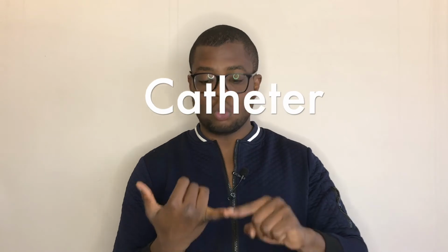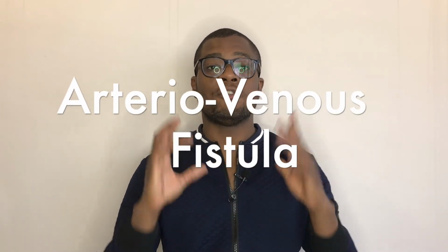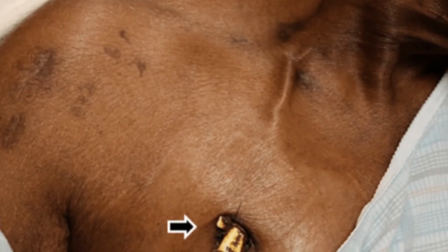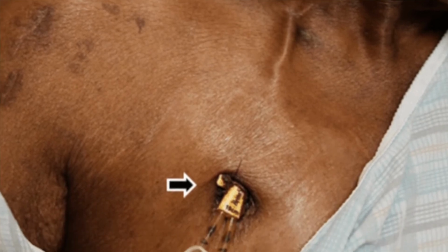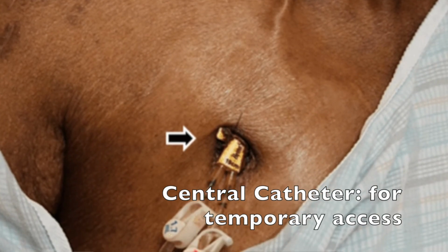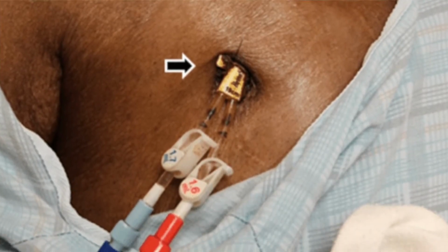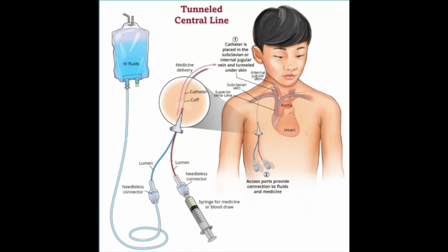There are 3 main accesses that you can use for dialysis, essentially because you need to remove blood from the body. It's either a catheter, an arteriovenous fistula, or an implantable graft. Now, starting off with the catheter. The catheter can be of 2 kinds. It's either a central catheter, which goes through a subclavian or a jugular vein for temporary access, or a tunneled catheter, which is placed just under the skin to prevent any risk of infection, and it typically lasts for 6 months.